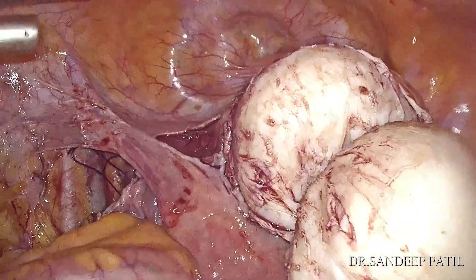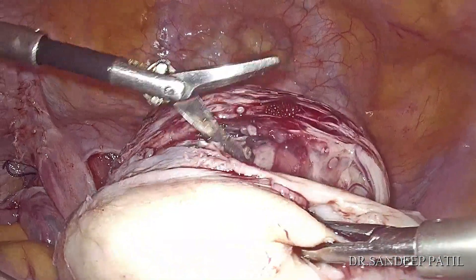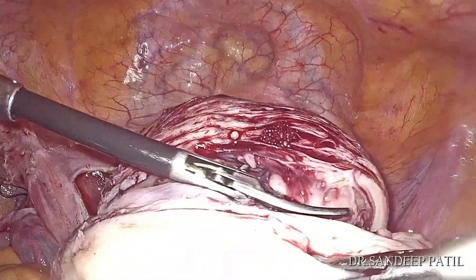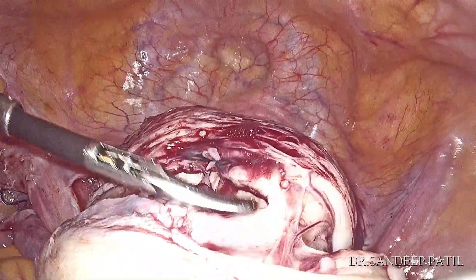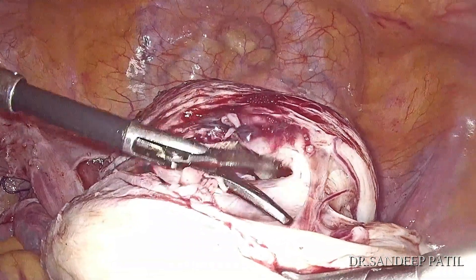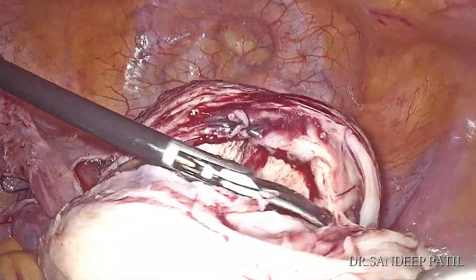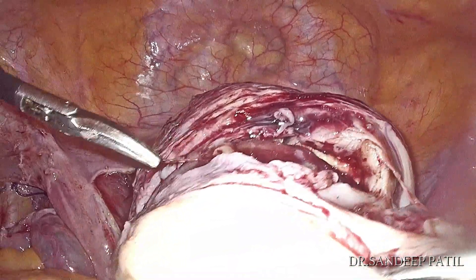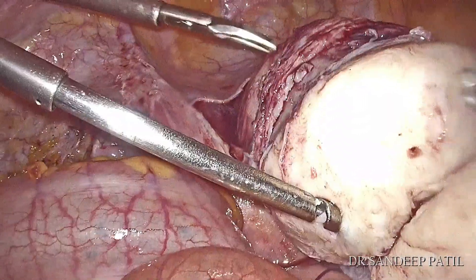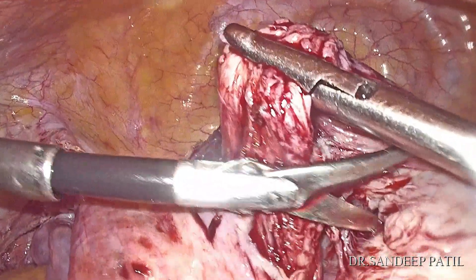You can notice the upper myoma has been completely enucleated and the lower myoma is now under our vision. With the help of the myoma spiral, this myoma is also enucleated using cold scissors.